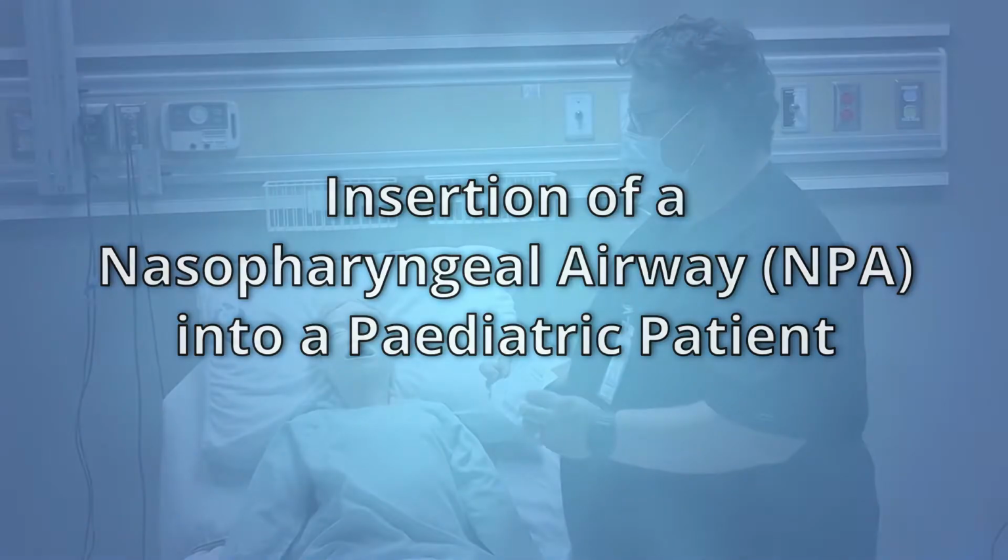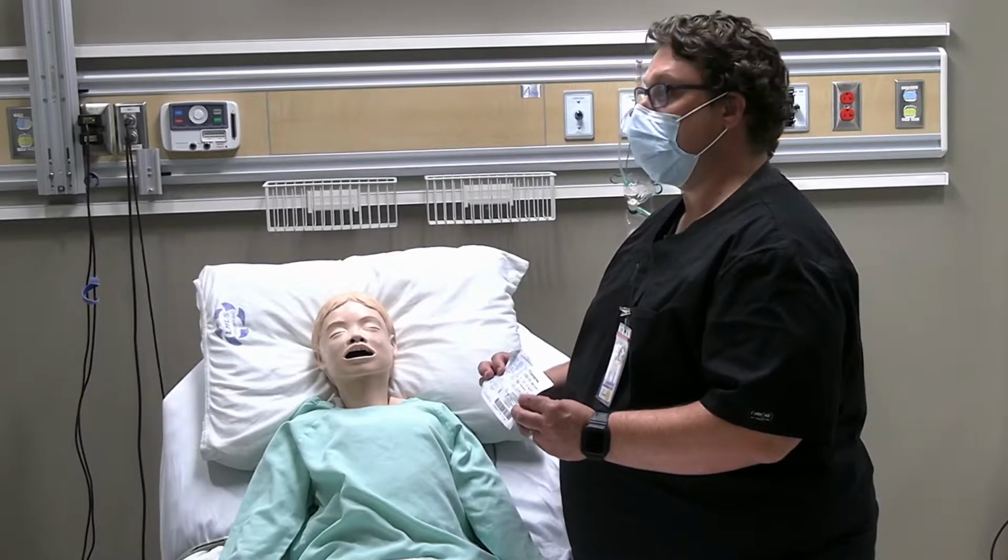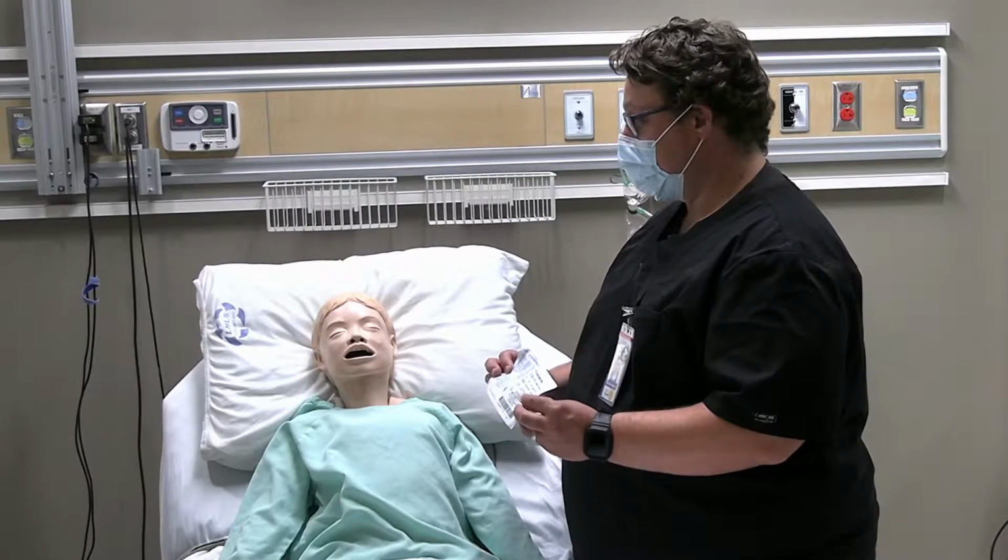So now we're going to demonstrate the use of a nasopharyngeal airway and its insertion technique.